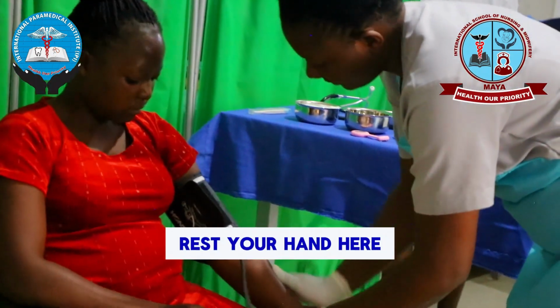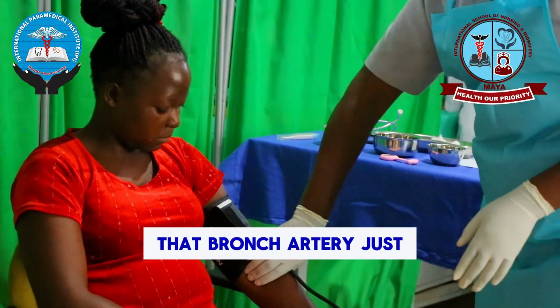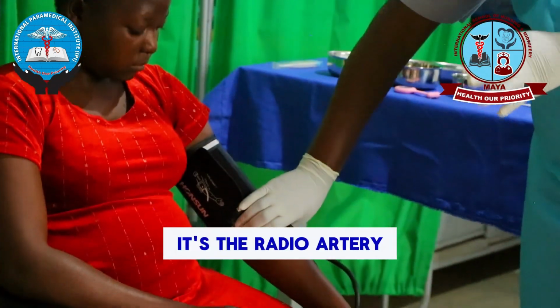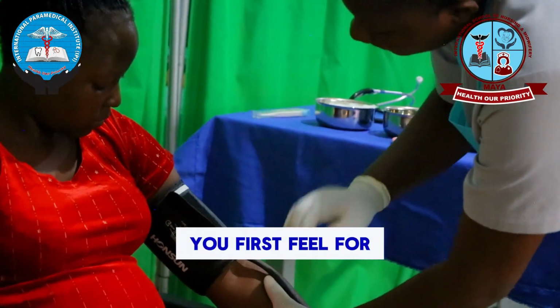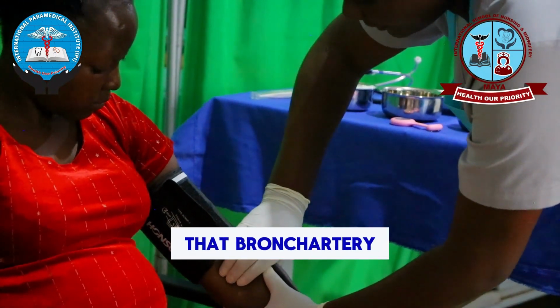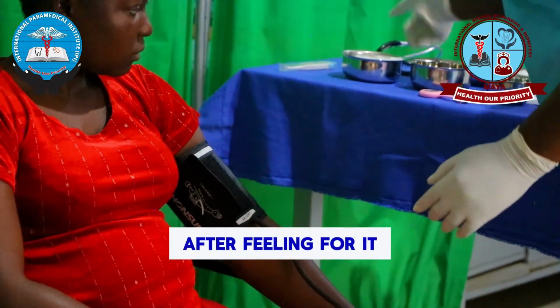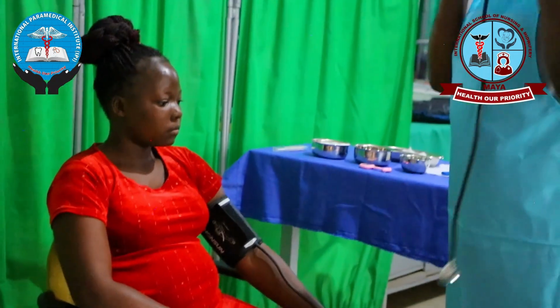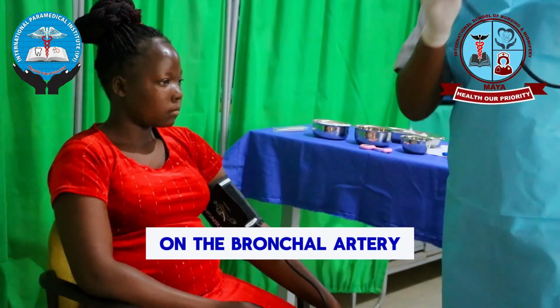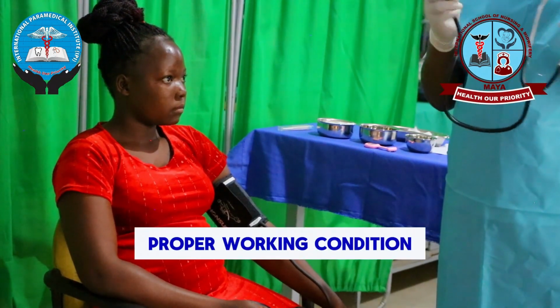Rest your hand here. So you feel for the brachial artery, just like we felt the radial artery. So before you start inflating, you have to first feel for the brachial artery. After feeling for it, you get your stethoscope. Before putting this stethoscope on the brachial artery, you must first ensure that it is in a proper working condition.